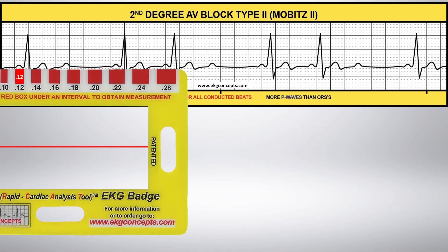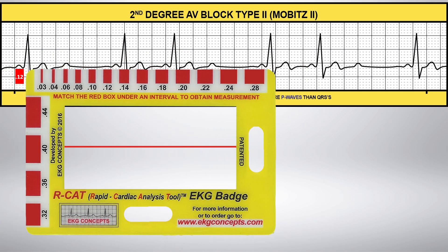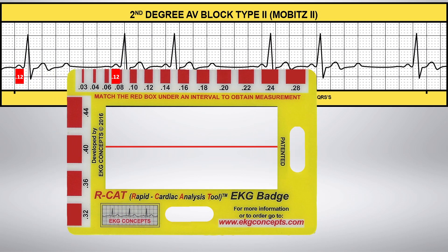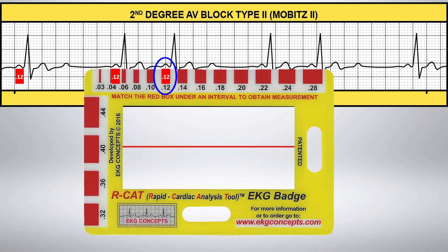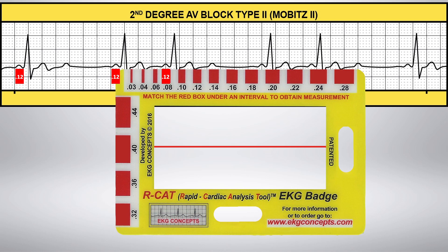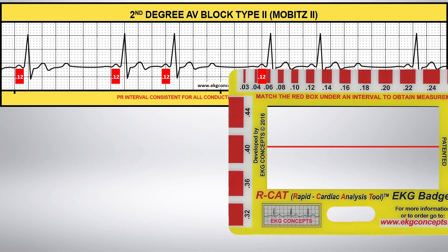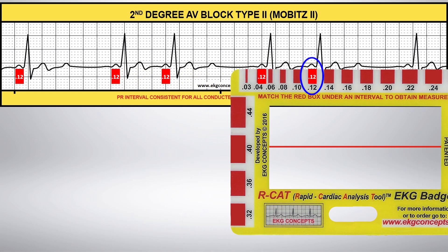Using the calibrated red boxes on the EKG badge, you will see that the P-R intervals are consistently 0.12 for all conducted beats. This is at the lower boundary of the normal range of 0.12 to 0.20.